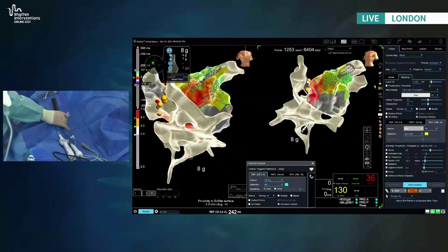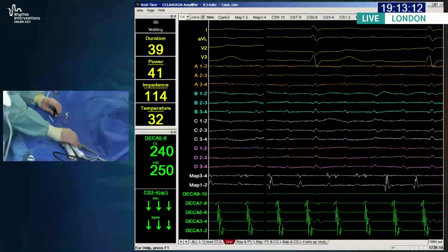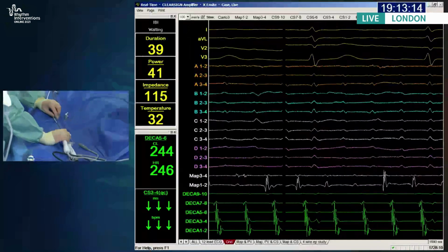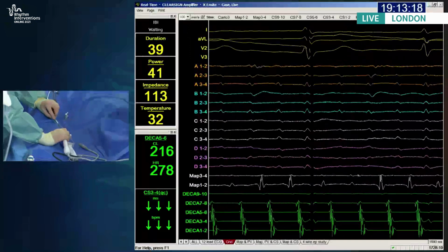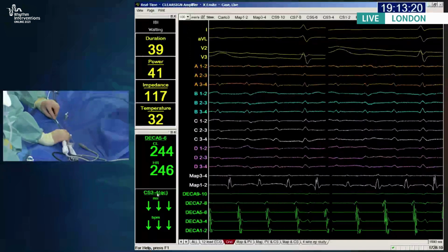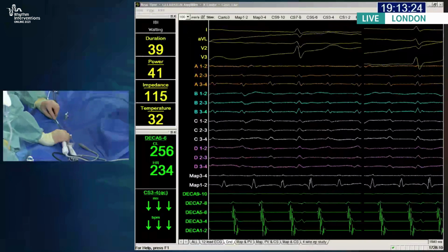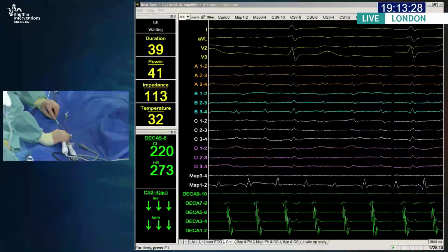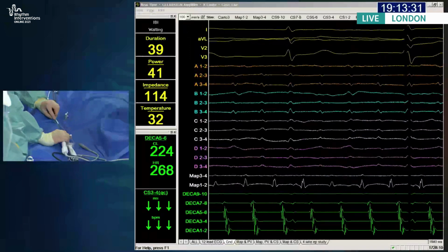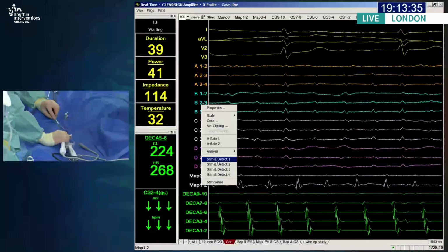Sorry, so the electrograms on the CTI are a little ahead of the proximal CS, and again very suspicious for flutter. Ross, we need... yeah, we go. Oh, sorry, I lost my sound for a second. We're off in conversation. Should we entrain here in a minute? So I'm fairly sure we're going to ablate a CTI line now, but maybe should we entrain just to convince the audience perhaps? So should we come on at 220 or so? Yeah.